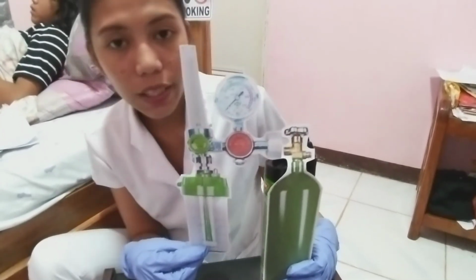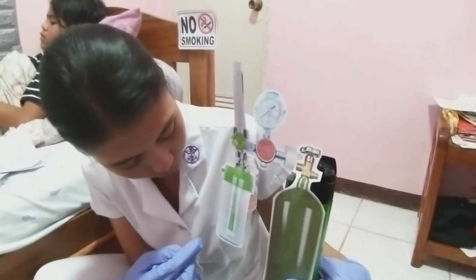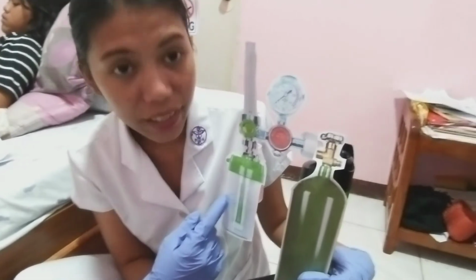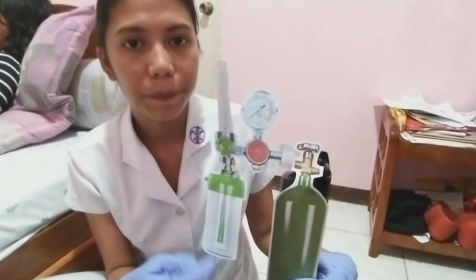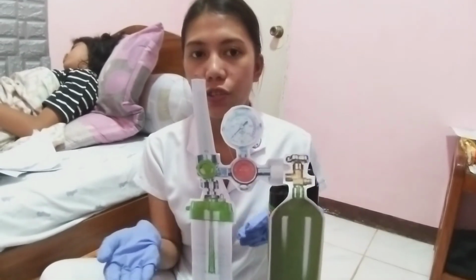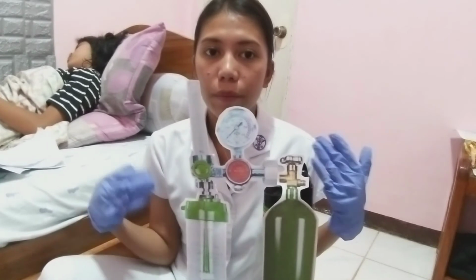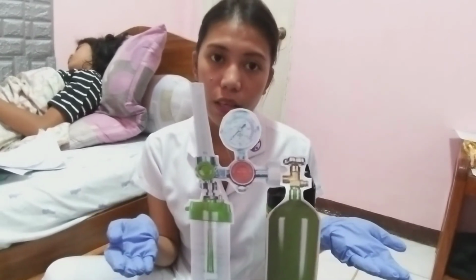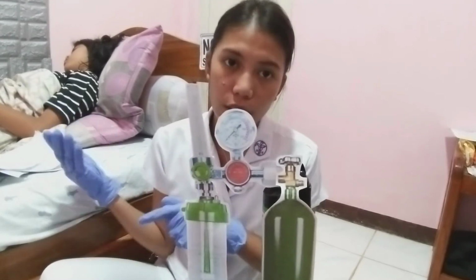I have already filled this with sterile water up to the line provided in the humidifier bottle. We need the humidifier bottle because it will prevent the drying of the patient's nasal mucosa.